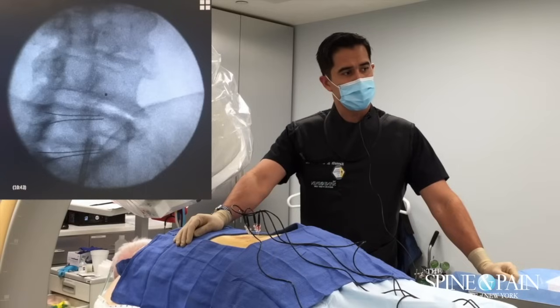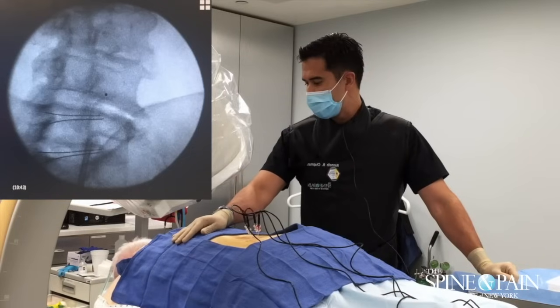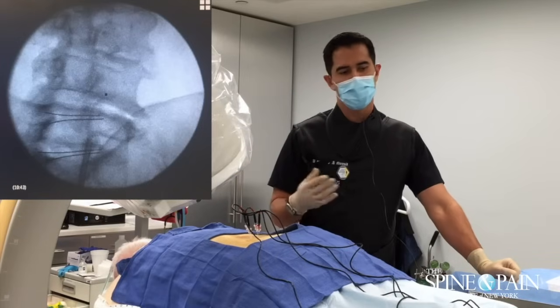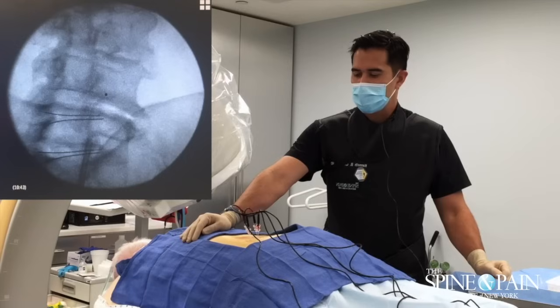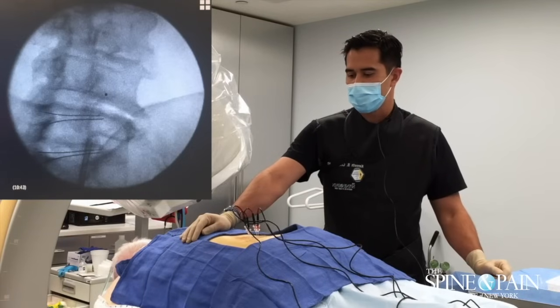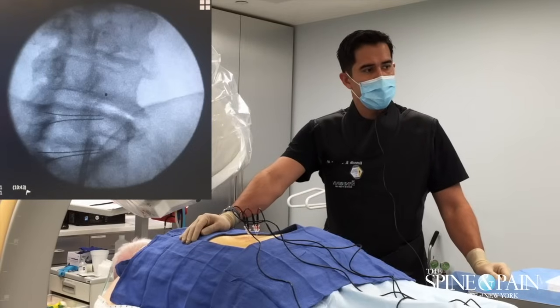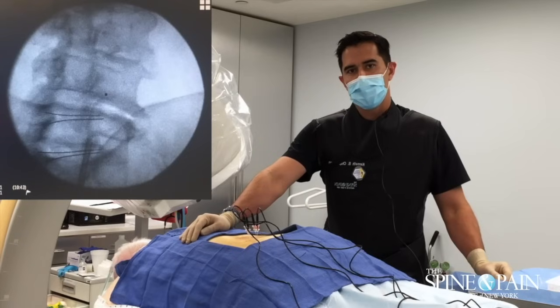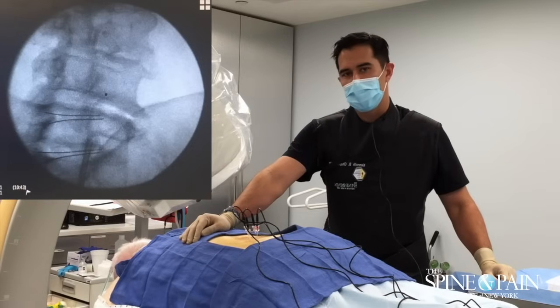You don't feel anything in the leg, or feel your legs pulsating or anything? Good. We're sending in an electrical signal to activate the nerve. If it were on a nerve root — which you do not want — you would have motor stimulation. There's no way you can block that feeling or stop your leg from twitching if you apply that degree of electricity. So we know we're not on that. We tested them individually and now we're heating them for one minute at 80 degrees Celsius, which is adequate to damage the nerve cells so they're no longer able to transmit the signal.